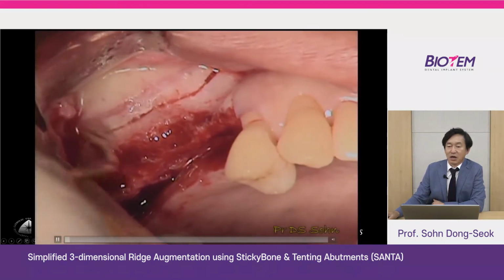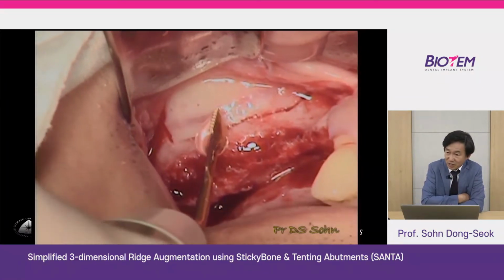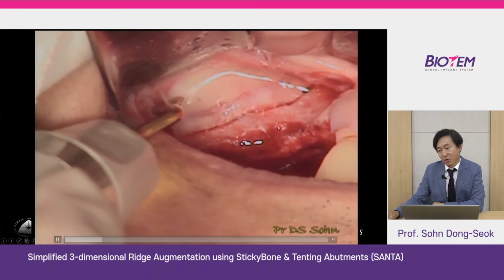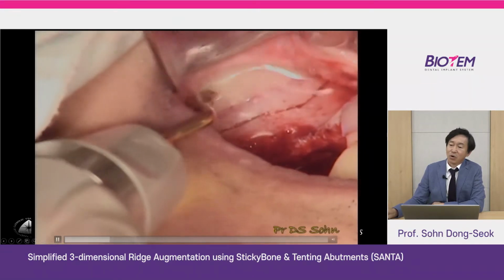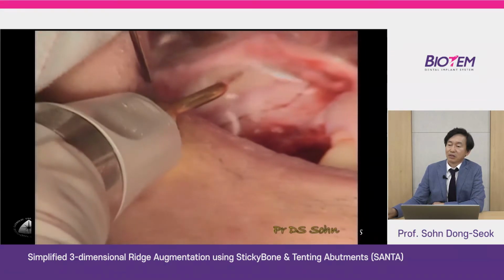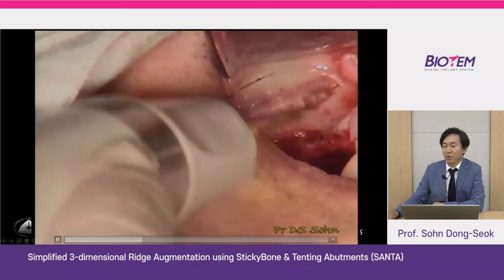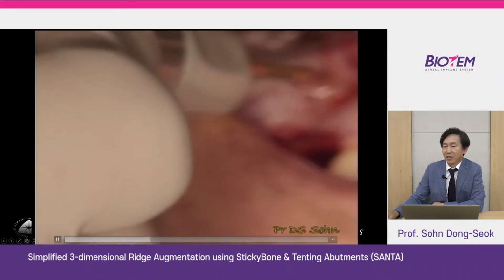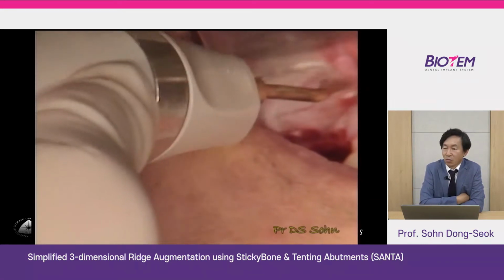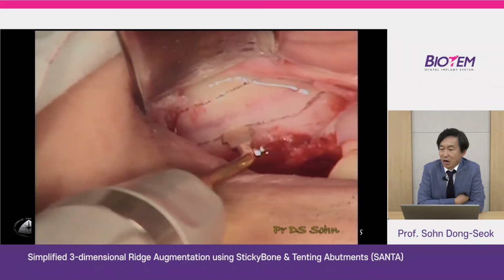So the lateral approach to sinus augmentation was used with piezoelectric bone surgery. You can see the artery inside the bony wall. A replaceable osteoinductive bony window was prepared with piezosurgery. Make sure to do a bevel osteotomy at the anterior osteotomy line and inferior osteotomy line in order to prevent displacement of the bony window after sinus elevation.